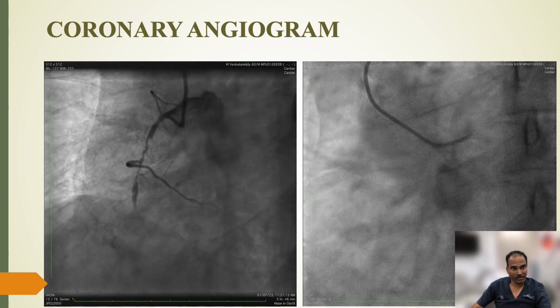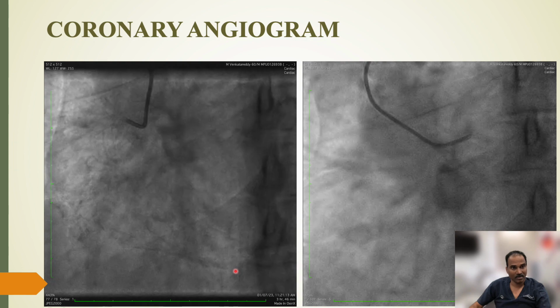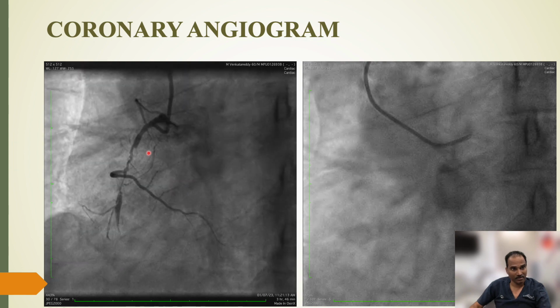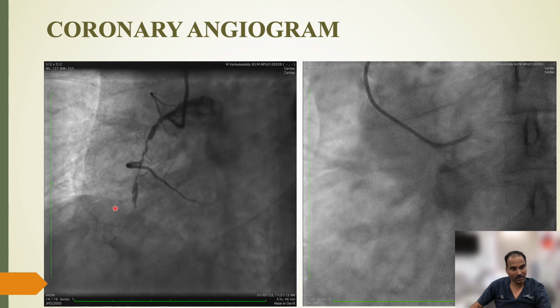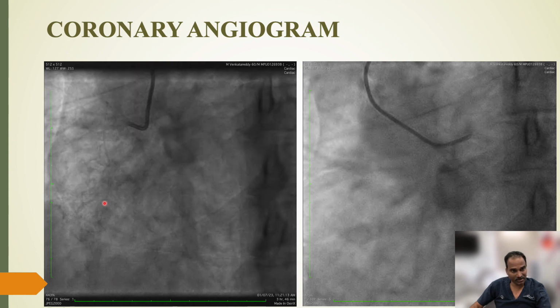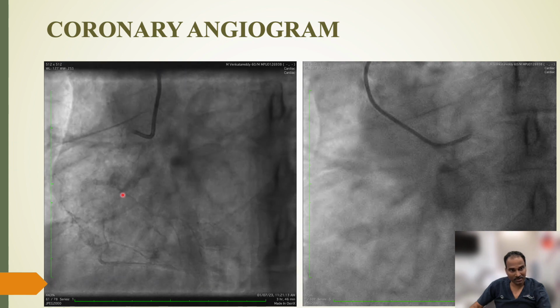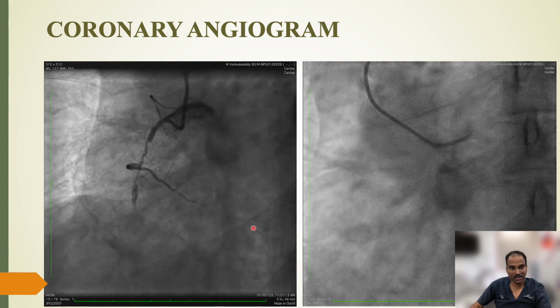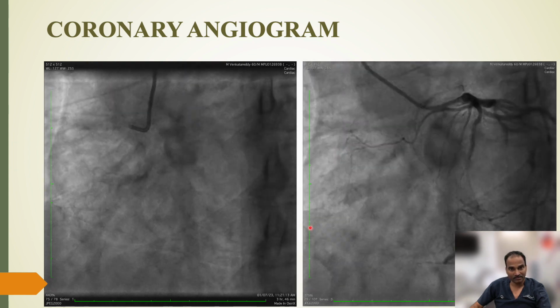This is the angiogram. You can see mid-RCA is diseased, but it appeared there is a good microchannel going along the CTO segment, but you can as well appreciate a lot of loops within the microchannel. Often it is very difficult to track these microchannels with our microchannel tracking wires.